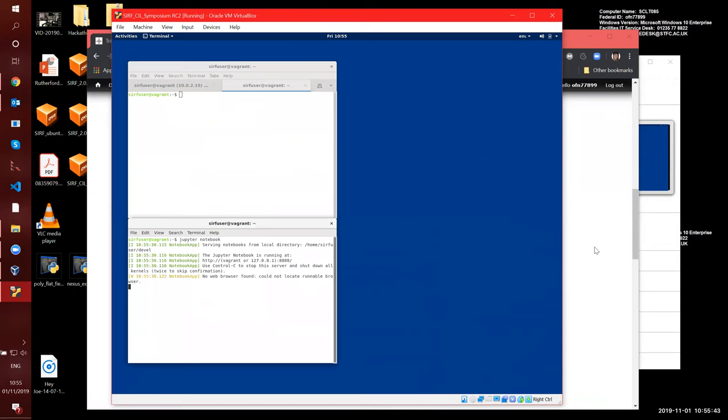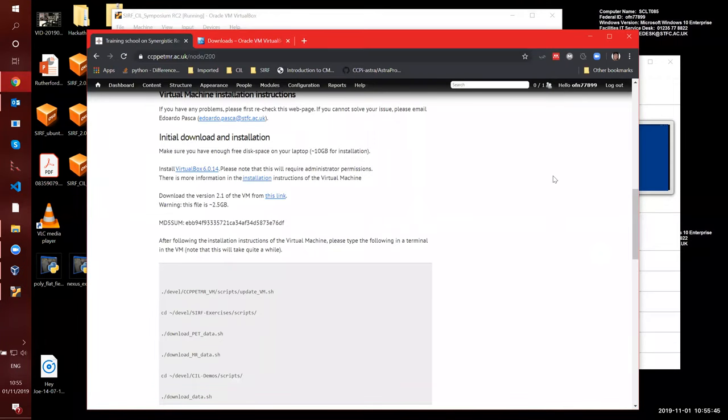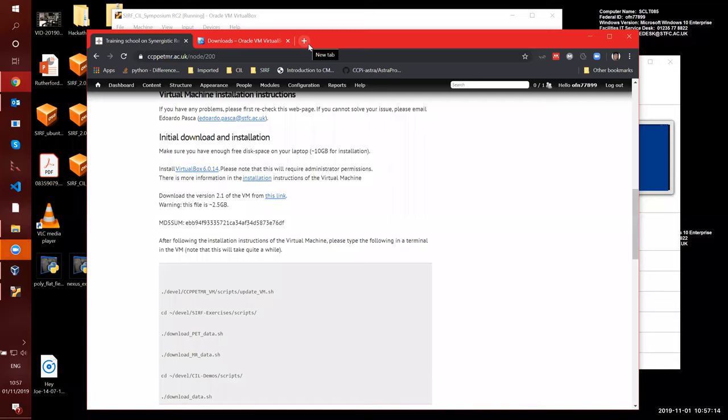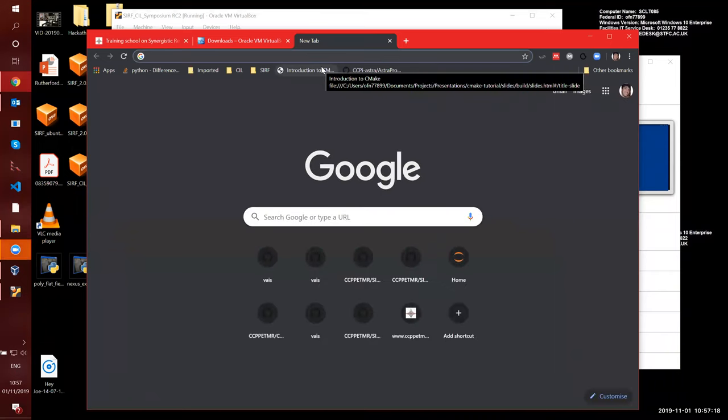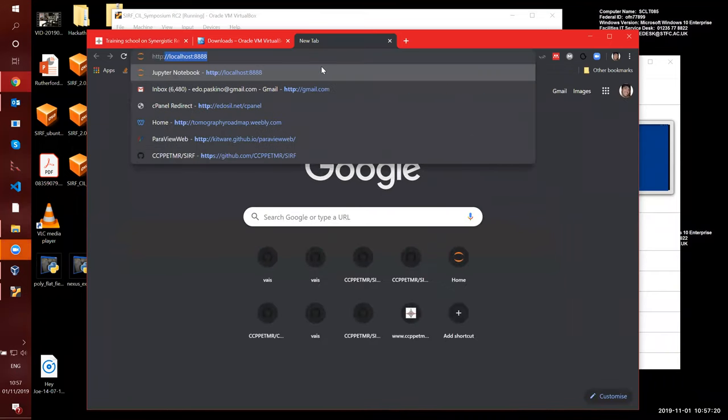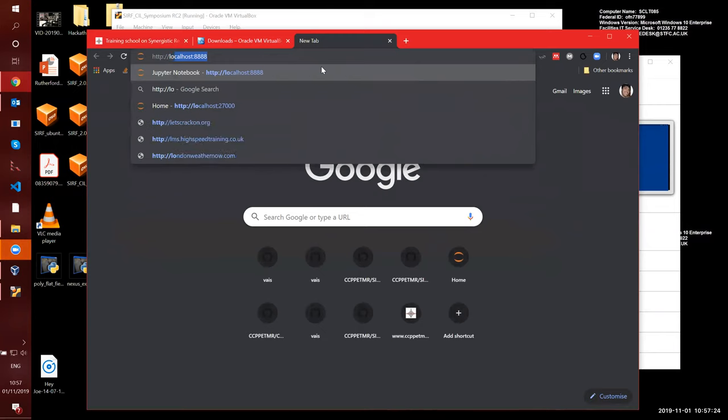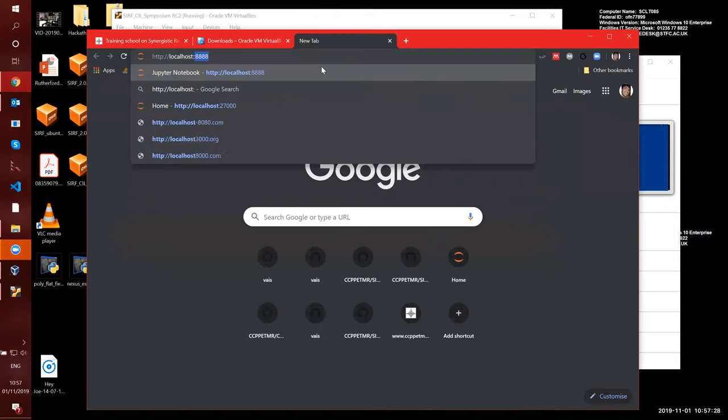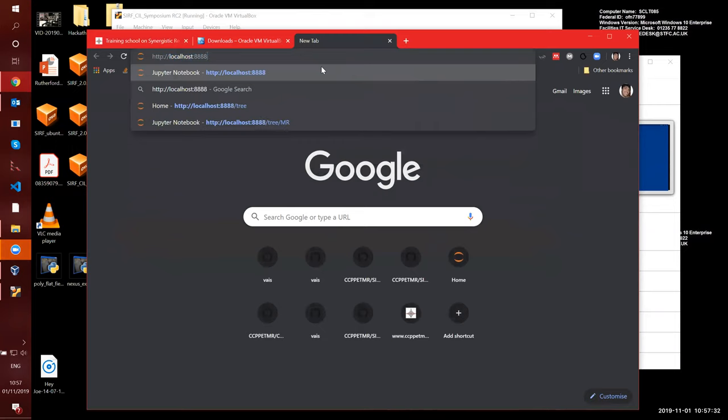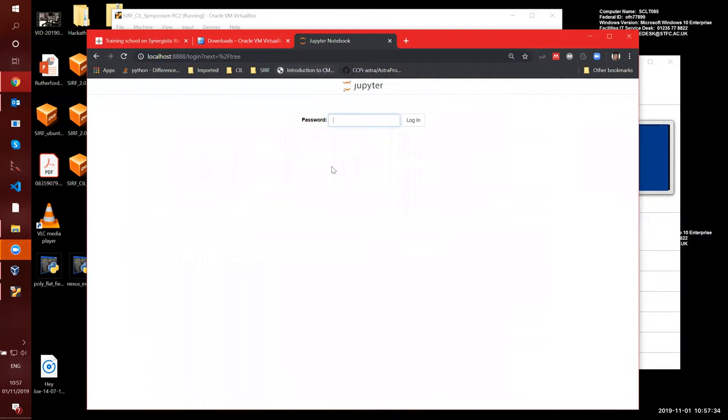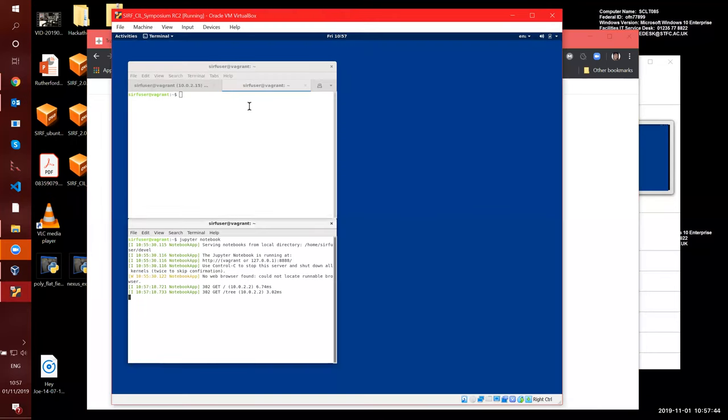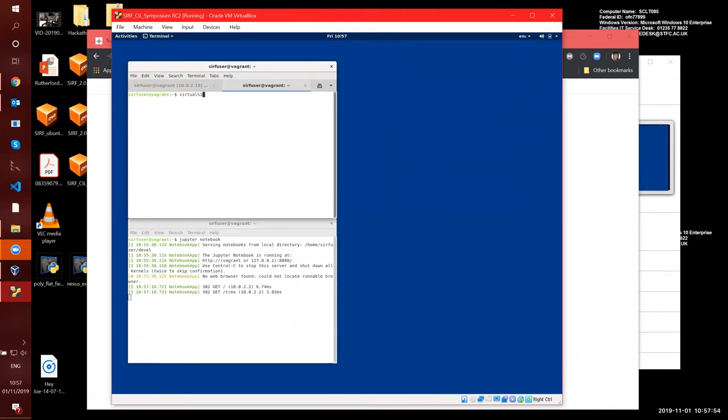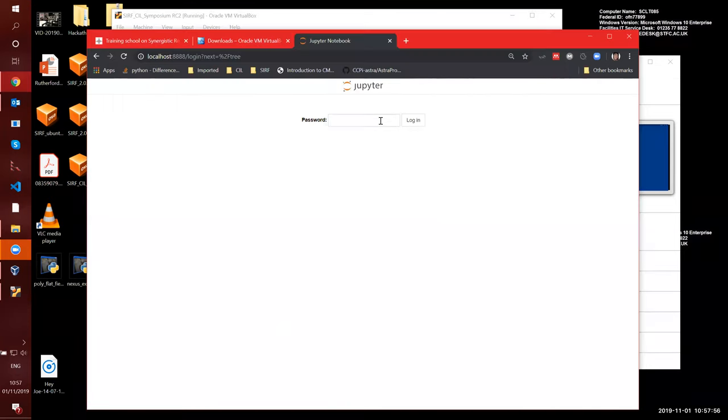So basically you can now go to your favorite browser, which in my case, it's Chrome. So you start your favorite browser, and then you open a new tab, and you point it to HTTP colon slash localhost, localhost, it's already there, but I'll type it 8888, and then you will come up to this screen, which requires you to enter a password, which is virtual%1. So I just type it here, so login is virtual, like that, login into the virtual machine, the login into Jupyter is virtual%1. So we go here, we write virtual%1, login.